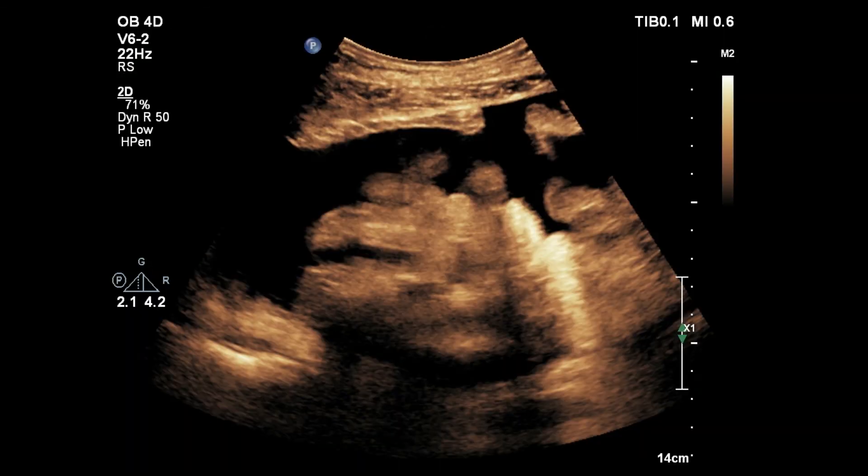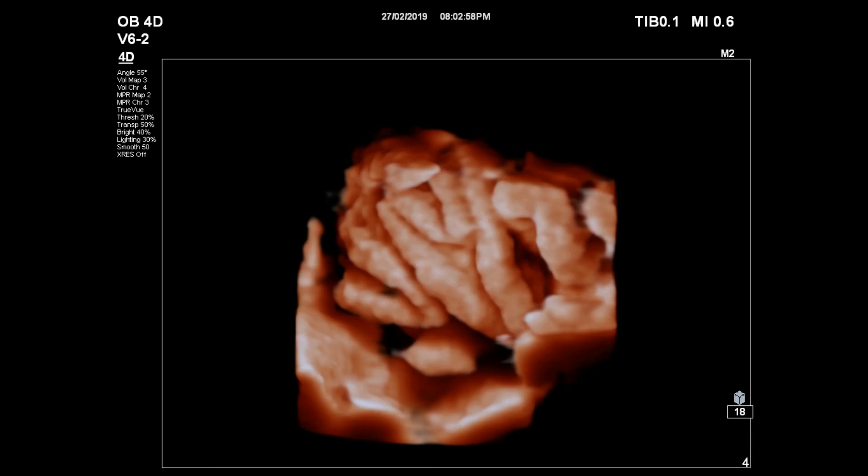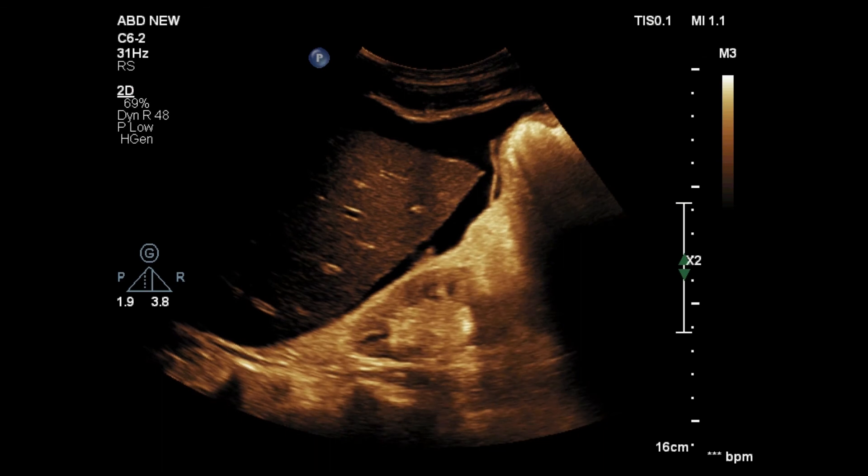Again, floating intestine is noted. There is a 3D reconstructed view showing how beautiful the small intestinal loops look due to ascitic fluid.